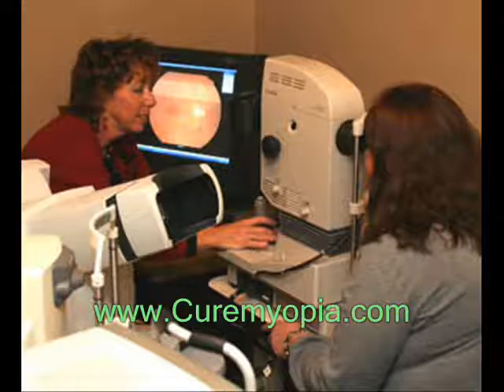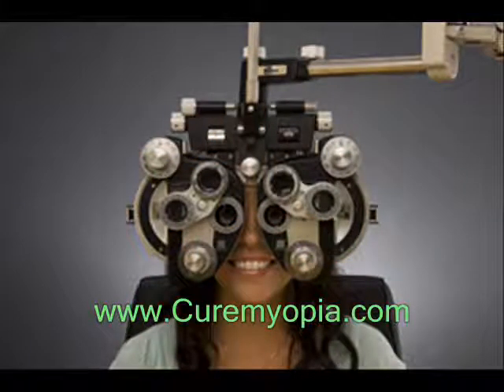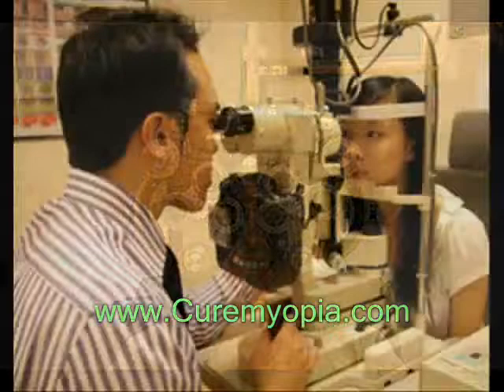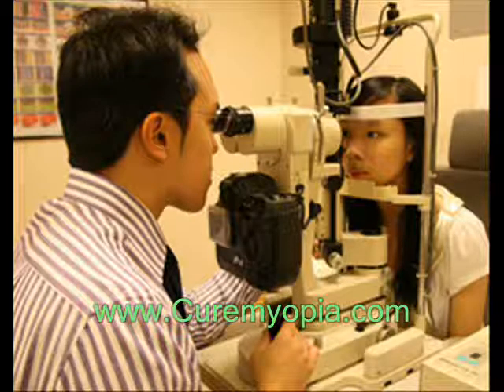You sit in a chair that has a special device called a phoropter or refractor attached to it. You look through the device and focus on an eye chart 20 feet away. The device contains lenses of different strengths that can be moved into your view. The test is performed one eye at a time, and the eye doctor will ask if the chart appears more or less clear when different lenses are in place.